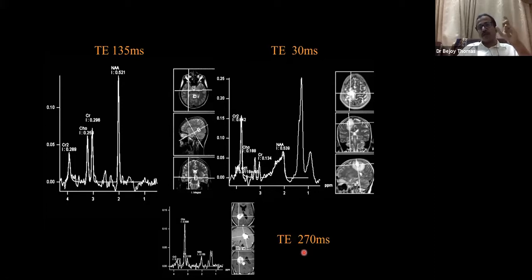So we have very limited time. Spectroscopy is added or decided at the end of an already long sequence. So you have to clinically validate the use of a spectroscopic sequence. You cannot run a spectroscopy for each and every case, and I will tell why. Because it takes time, and if you don't get a good spectrum, you may have to repeat it. So only when it is really useful, that's why I will show a series where it is really useful and where it may not be really useful.